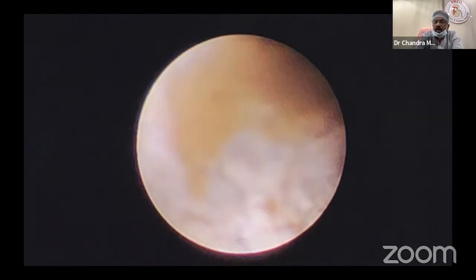One important question asked is about a bigger nephroscope. I must tell you, I am already using a 15 French Ampla sheath. There is no nephroscope between 12 and 15 except from one company, Wolf 13.9. If you wanted to use the next size, it is 18, so you have to dilate up to 20.